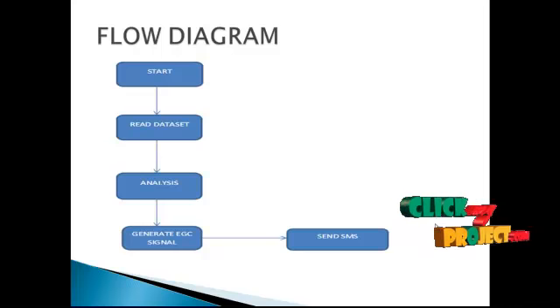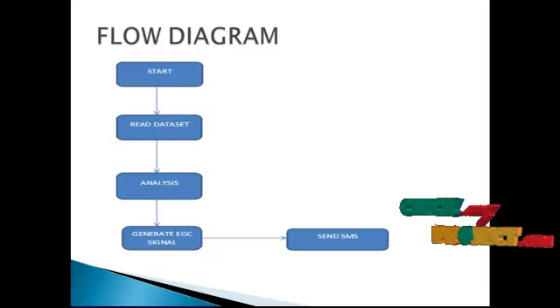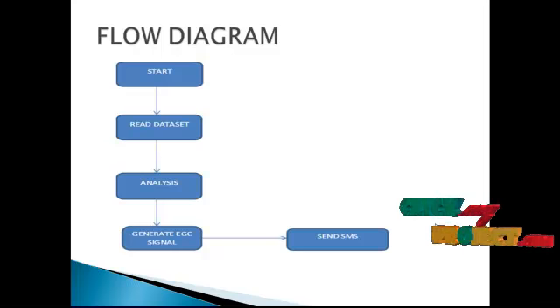The read dataset module is used to read the dataset from the devices. After reading, the dataset will be analyzed through the Android system. After analyzing the ECG signal, the alert will be generated.